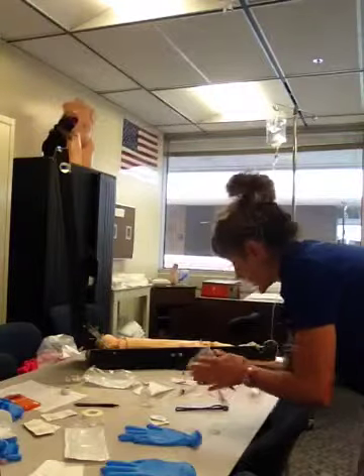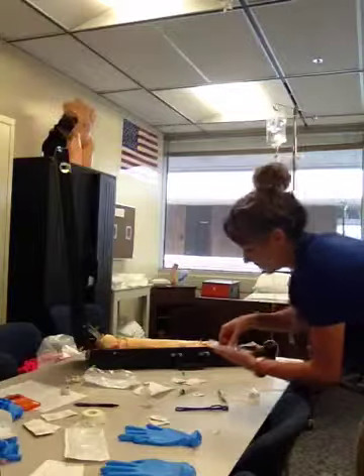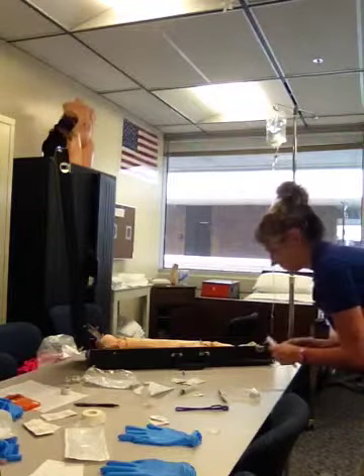And now I'm going to mix the medication. And I'm going to apply a label, which has the client's name, the dosage, the drug, the time, and my initials.